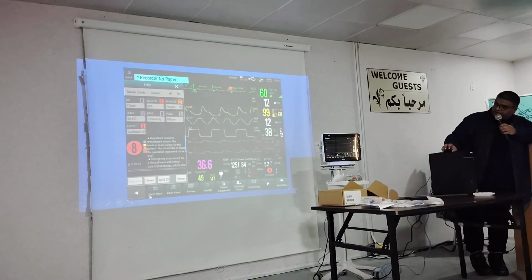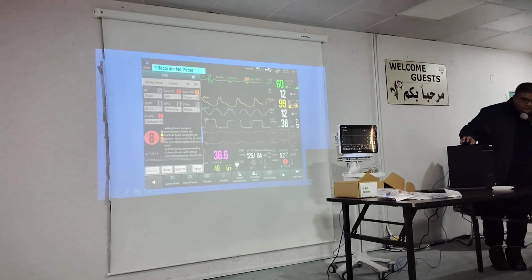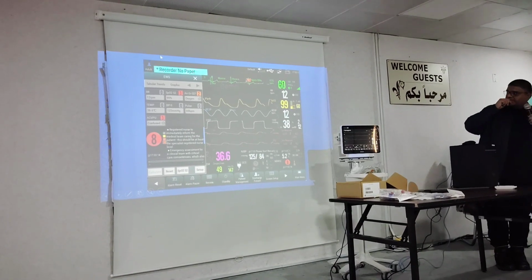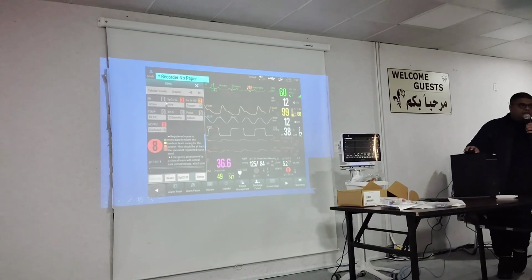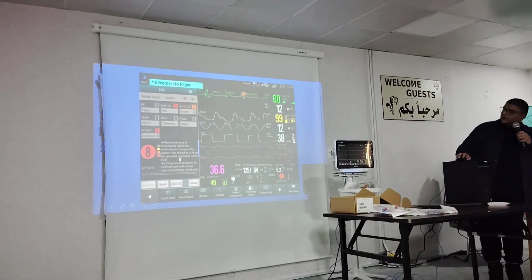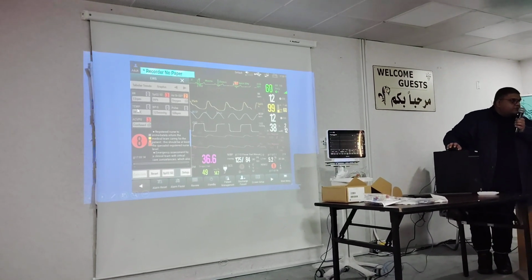You can go over here in the settings, in the setup, and change it to MEWS. You should be able to read what you need to do for the patient and how to inform, or you can enter the values. Some of them are automatic, for example respiratory rate.